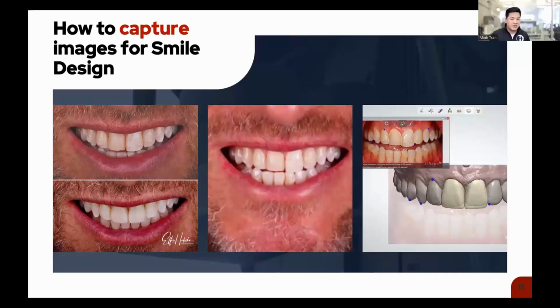One really quick dental tech tip here is to make sure that the patient's head is level, right? So when you look at it here, that they're not tilting forward or tilting backwards, just because that introduces perspective distortion between one photo and another. So when you're trying to align these photos, you want to make sure that their head is very level with the camera. Take a little bit of care, look at them and tell them, you know what, keep your head nice and straight. Take one photo, put the retractors in, take the next photo. It'll give you much more accurate results.